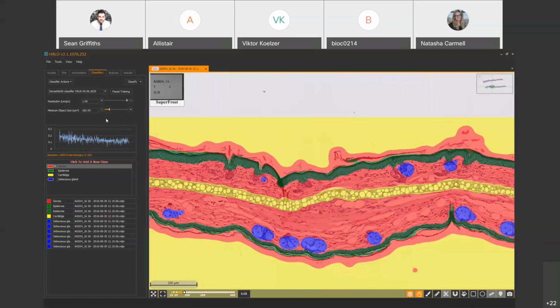Yeah, that'll be interesting to see, especially sometimes when you have big cohorts of colorectal cancer, for example, you've got this huge range of appearance from signet ring to your classical, reasonably well differentiated one, and it's very difficult to try and catch all because they look so different.